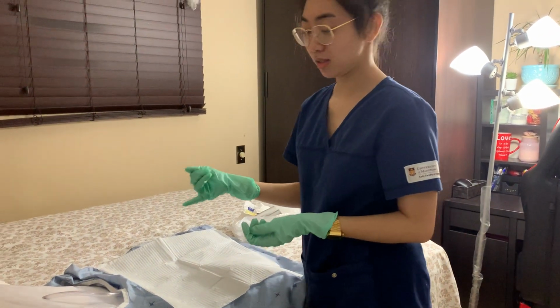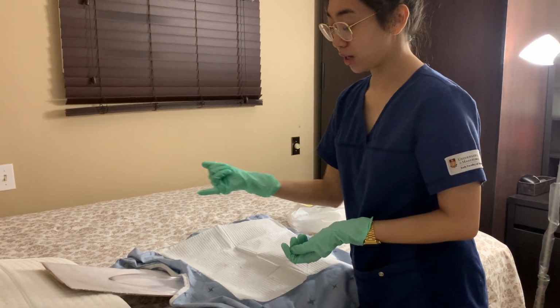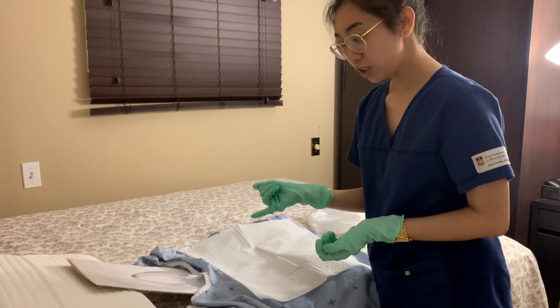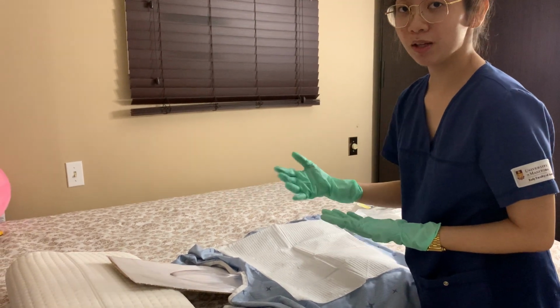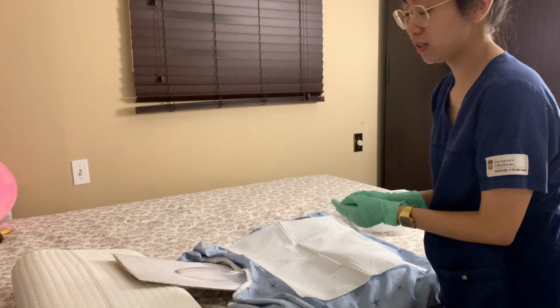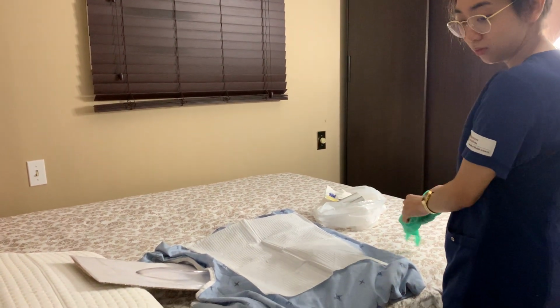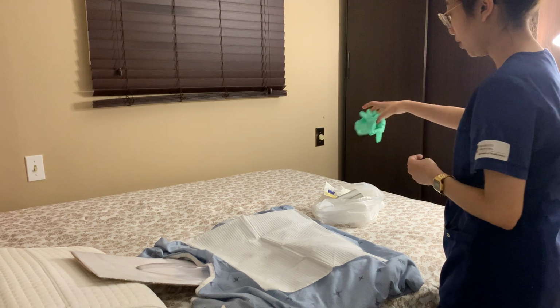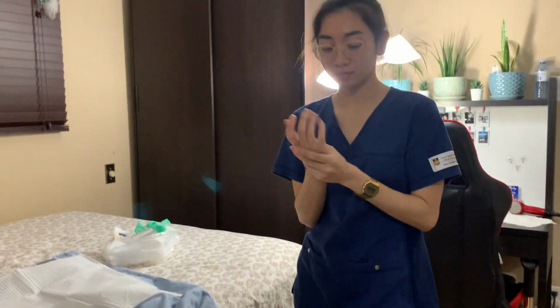And now I'm going to assess the site. I can see that there is no redness, the periwound skin looks healthy, and that there is no drainage, which is good. And also there is no foul odor or purulent drainage, which means there is no infection. So I'm just going to remove my gloves now. Garbage. And I'm going to clean my hands again.